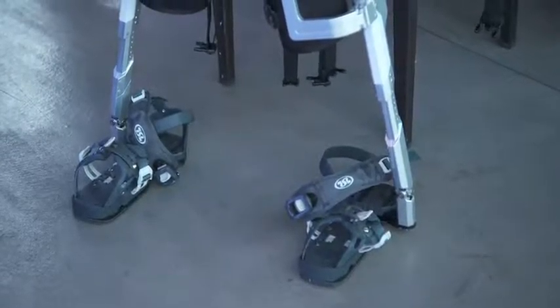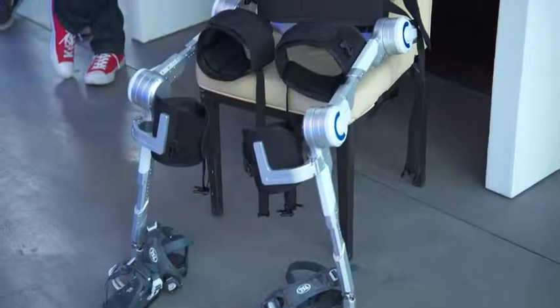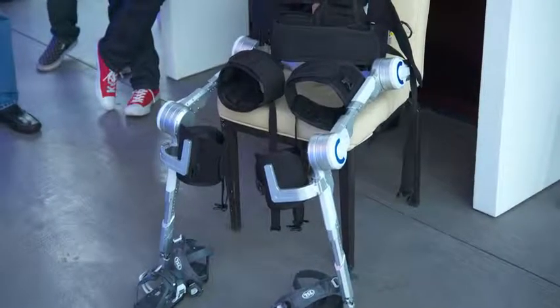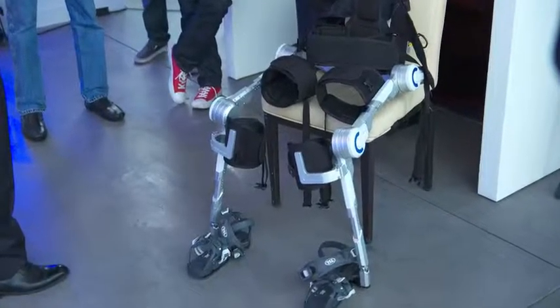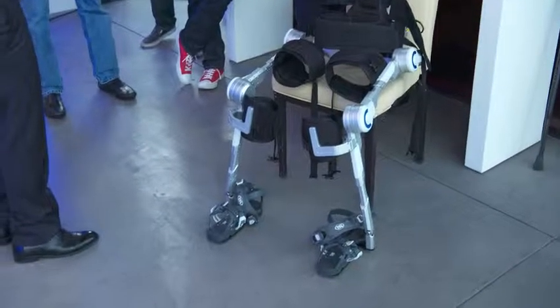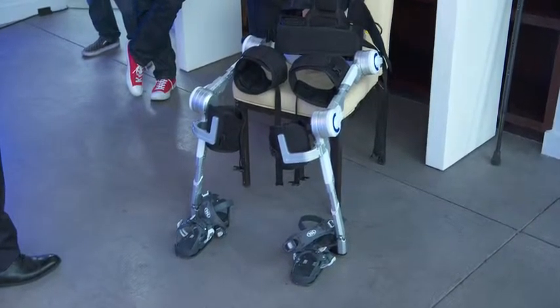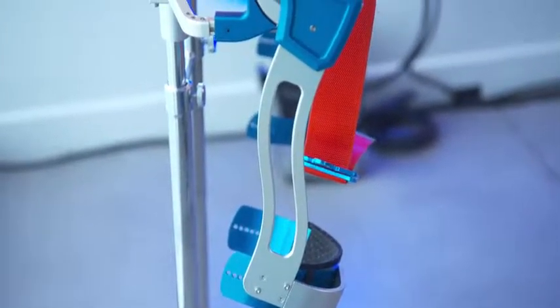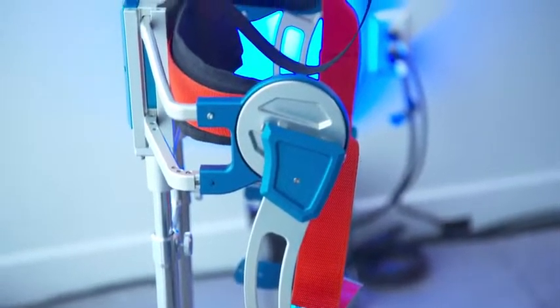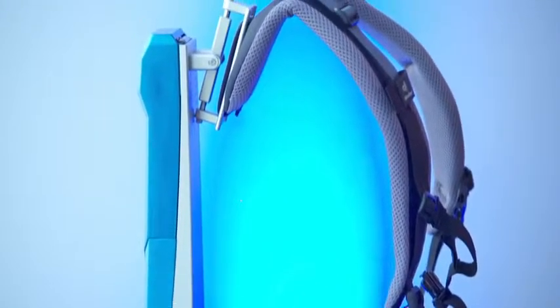Controllability is totally on just the lower extremity. This one functions like motion created. Some doctors said this kind of robot can be very, very helpful for rehabilitation while lengthening their life cycle.